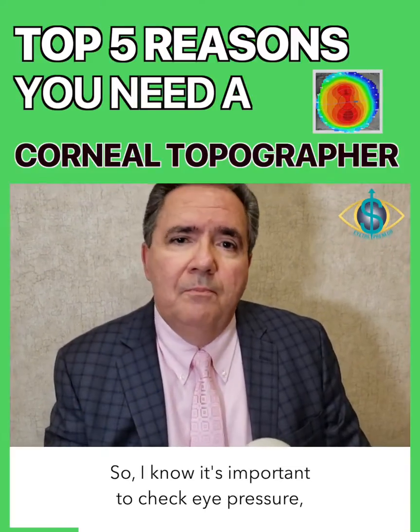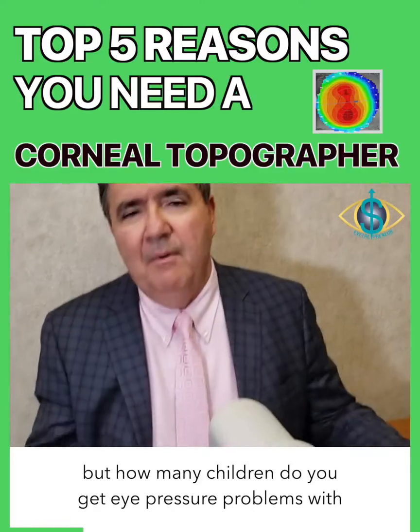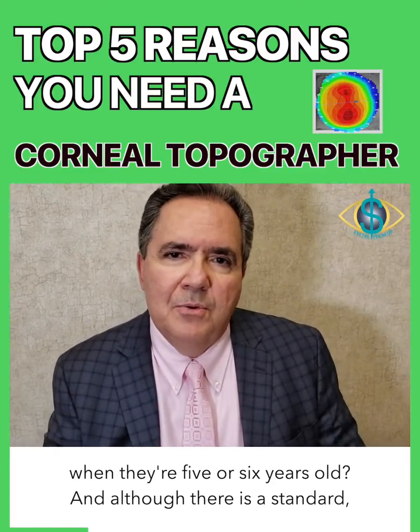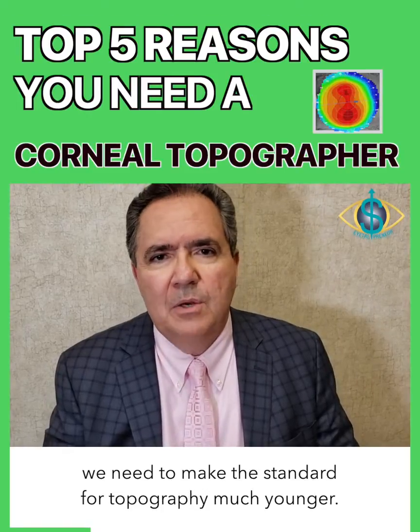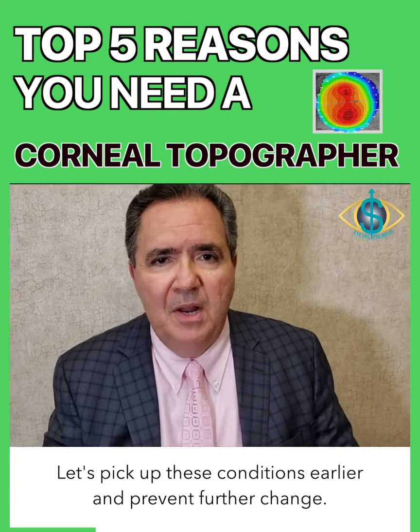keratoconus. So I know it's important to check eye pressure, but how many children do you get eye pressure problems with when they're 5 or 6 years old? And although there is a standard, we need to make the standard for topography much younger. Let's pick up these conditions earlier and prevent further change.